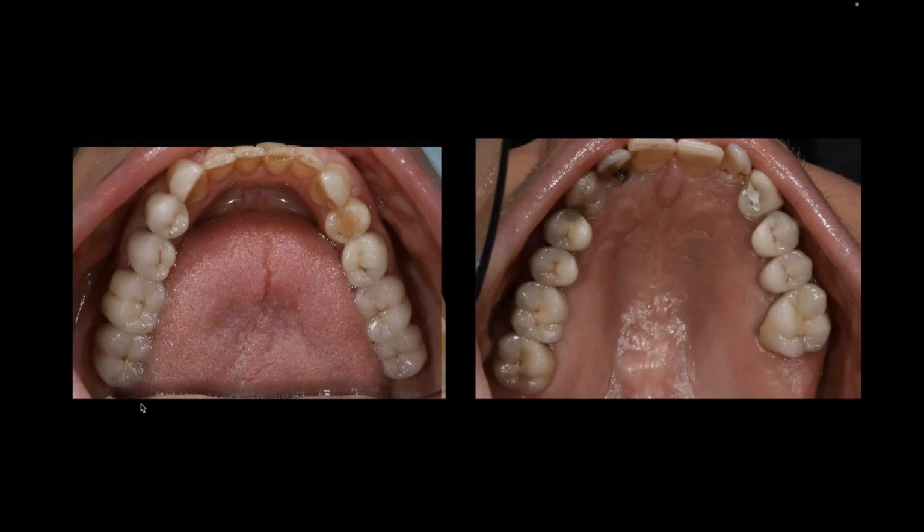What's the sense of us taking a beautiful library and putting it on our printed model, or hand building a beautiful anatomy, if in the end, when the doctor puts it in the mouth, they're going to grind it out? And that is a failure to us, and also it doesn't create our value. So one of the things that causes the biggest problem here is our understanding of what I call arc of closure. And the challenge here is that this is not in a CAD program, this is in your brain and your ability to understand.